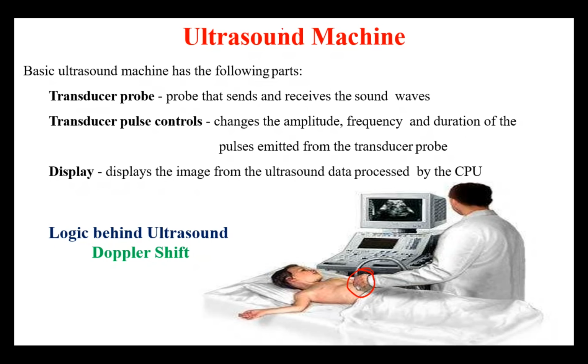Okay, so those things apart, the ultrasound machine consists of a few important parts. Other common parts I have not shown here, for example CPU, printer, and all. So that's not needed. One important thing is the transducer probe. So can anyone say what is the transducer used for ultrasound? Which transducer is preferably used for acquiring ultrasound? You have studied definitely in sensors and measurements. Piezoelectric.